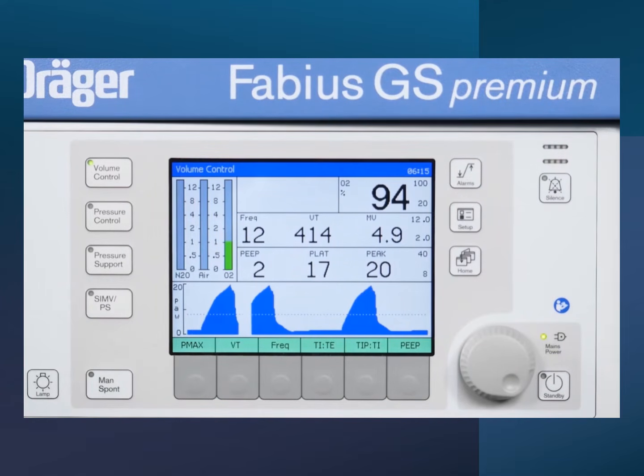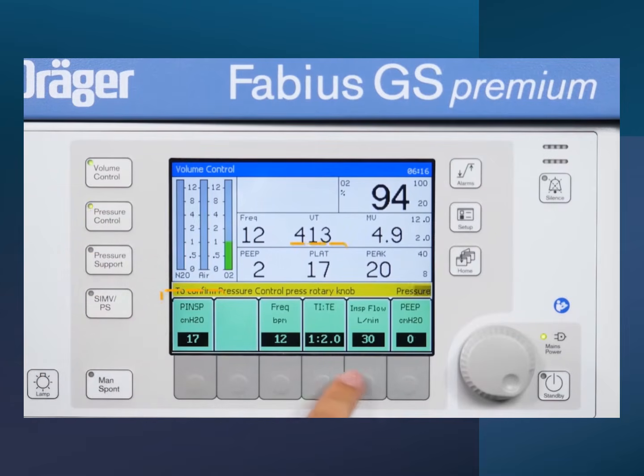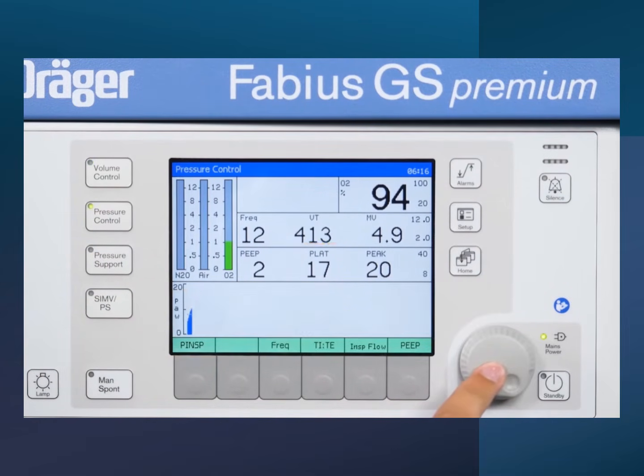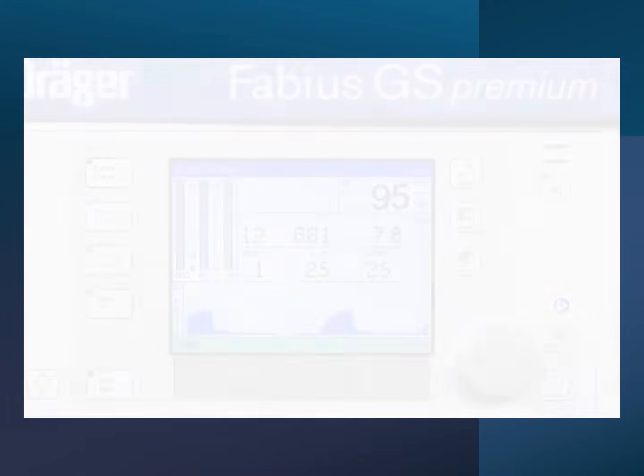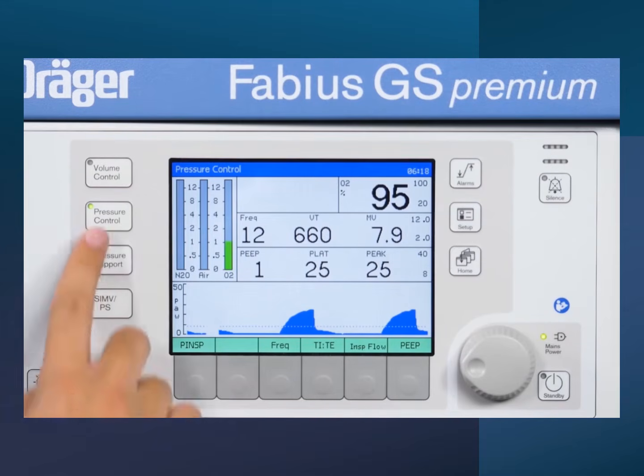So here, the patient is being ventilated on volume control, and this person wants to change to pressure. So they press it once, they can check and change, and they confirm with the wheel, and now they're on pressure control ventilation. You can see now the ventilator actually gave suggestions for what those numbers should be. Here we're now ventilating at 25, you're getting 660 mils.